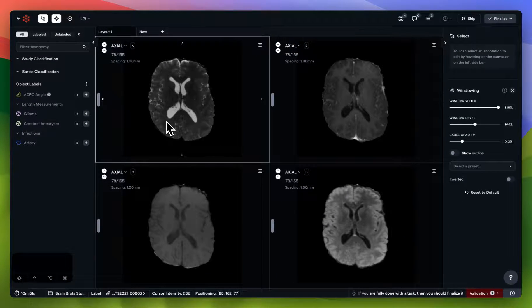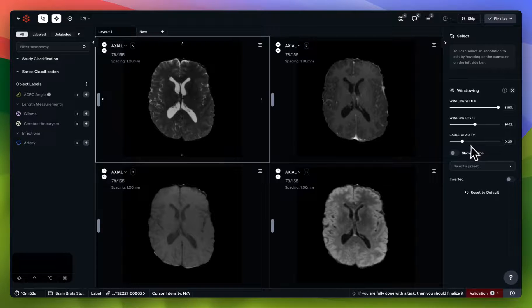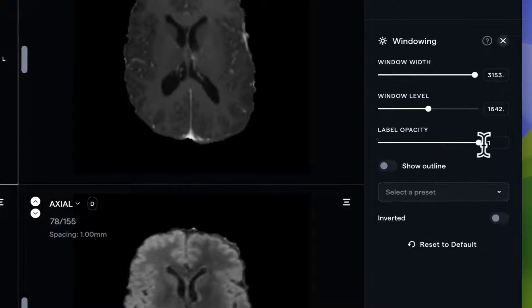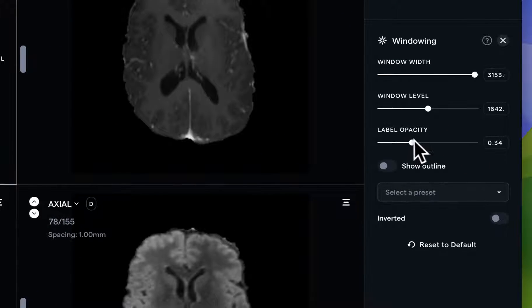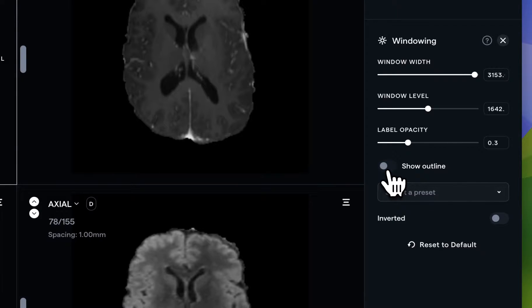At this point, the top left viewport. You can also control label opacity for any annotations that you've drawn, as well as decide whether or not you'd like to see the outline of that label.